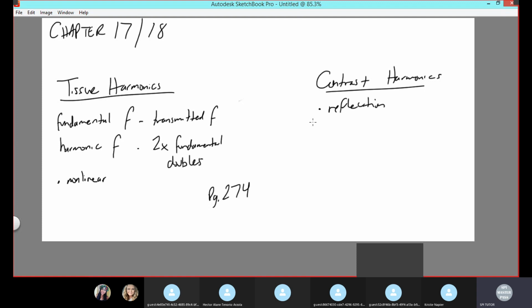So I have no real way of helping you remember it besides two little tips. And they're a little bit of a yoga stretch, but just bear with me. So tissue harmonics is tissues, T for transmission. All right, so it's nothing crazy. But for contrast harmonics, I scan echo, and in echo we use contrast. And whenever we use contrast, the image looks a lot prettier.